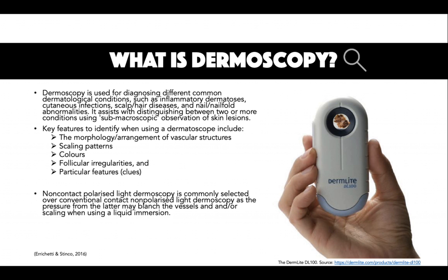Consideration needs to be given regarding the individual's family history, the location, number, morphology, and distribution of the lesion to ensure that dermoscopic findings are accurate for different skin conditions. Although most skin conditions have certain dermoscopic patterns, others display non-specific features. For this reason, proper and accurate clinical information needs to be considered to assist with diagnosis.